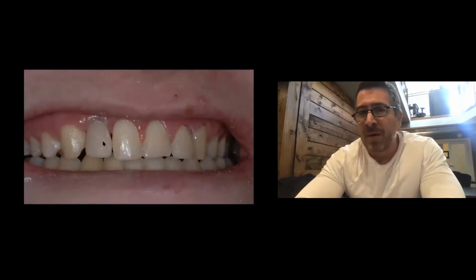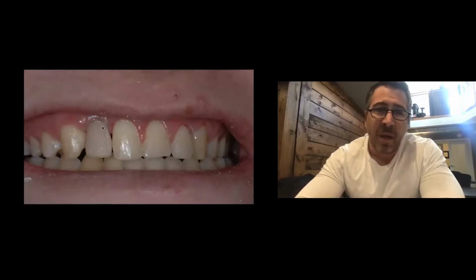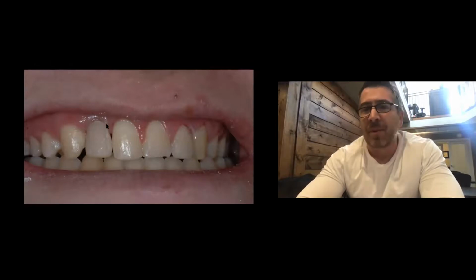That's just a temporary crown because if you look at all of this patient's teeth, they're not nice. I did a little bonding here because he had a peg lateral quite some time ago, but he's gonna have veneers done on the 1, 1, and the 2, 1 because they're not symmetrical. But look at the zenith. The zenith is in a better position because the implant shoulder was placed at the right spot.